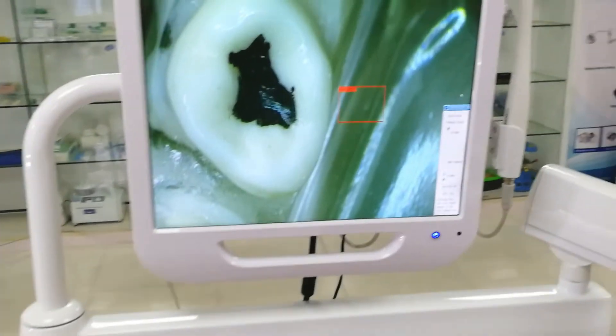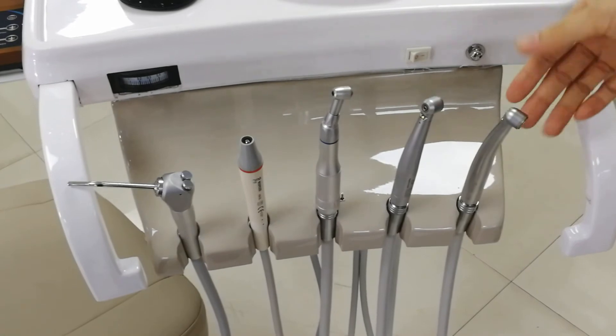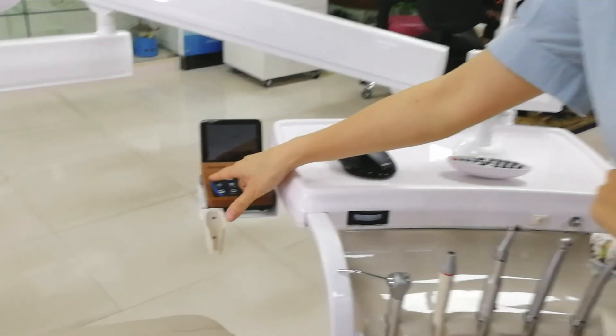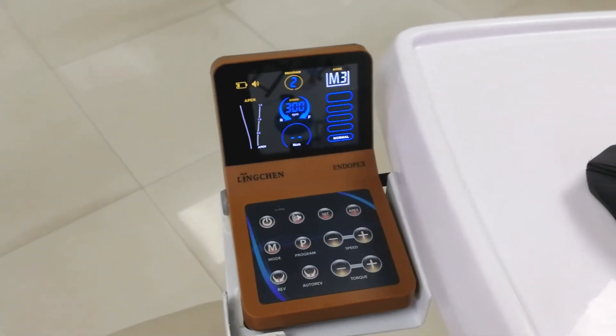Let's see the other options. This is the built-in auto camera with Sony lens, an LED scaler from Woodpecker, two handpieces with LED light, and a curing light. We also install another 2 options: a built-in endo motor with apex locator, and a built-in implant motor.